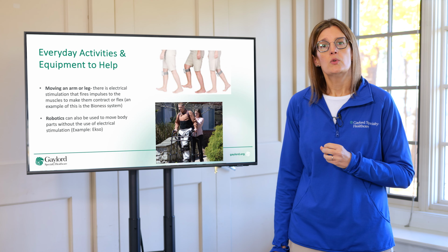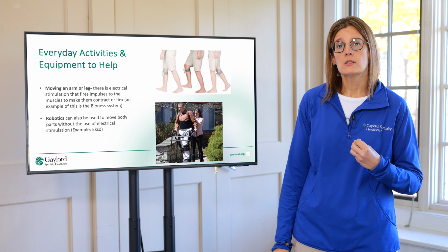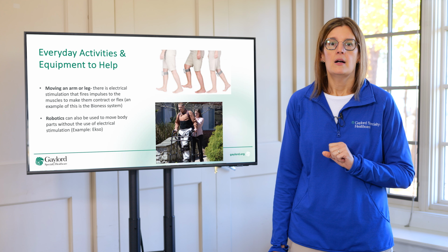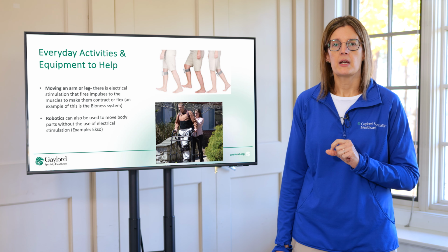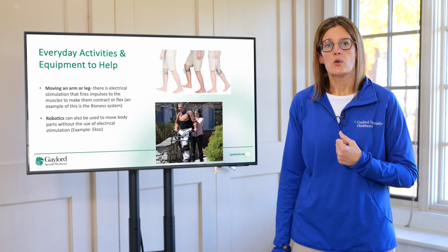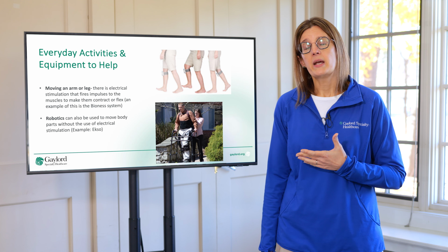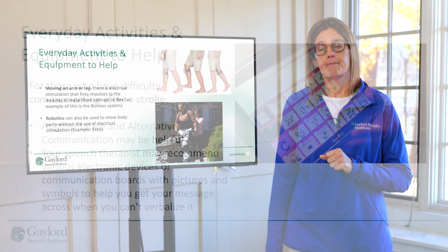It is very beneficial even for those that are able to walk if we're trying to work on building endurance, or if we were talking about earlier difficulties with good motor control or perhaps balance. This tool is also particularly effective for folks who may have difficulty with midline positioning. We talked about how some folks after a stroke are used to keeping their weight over their strong side, and now we are working with them on being able to tolerate their weight on their weaker side to build their strength and their endurance with walking.